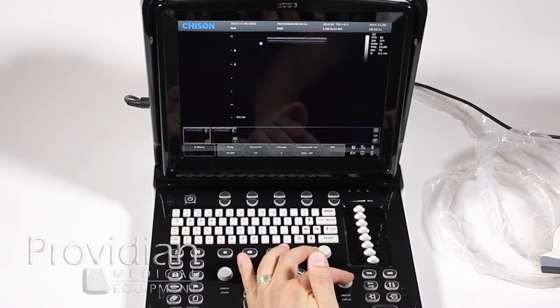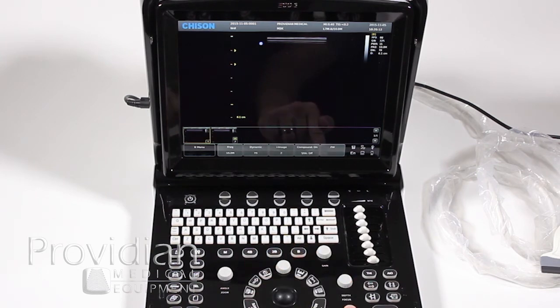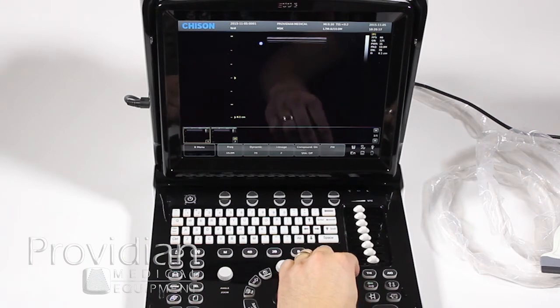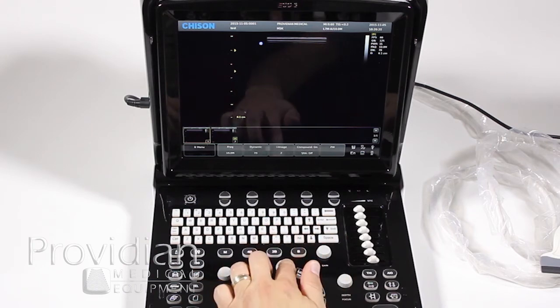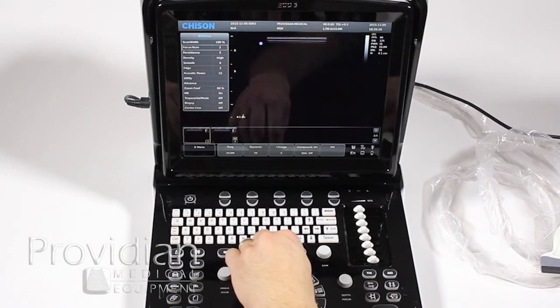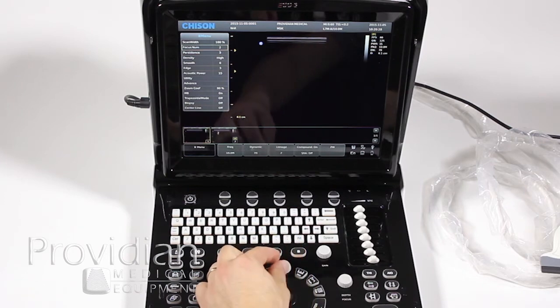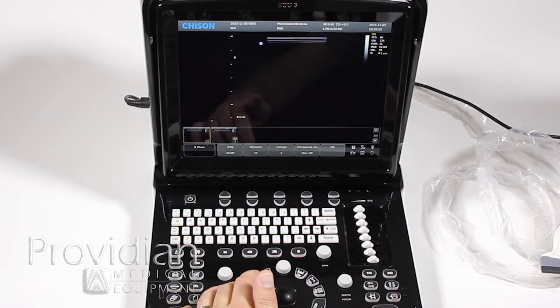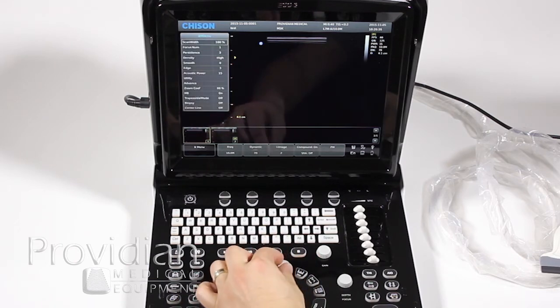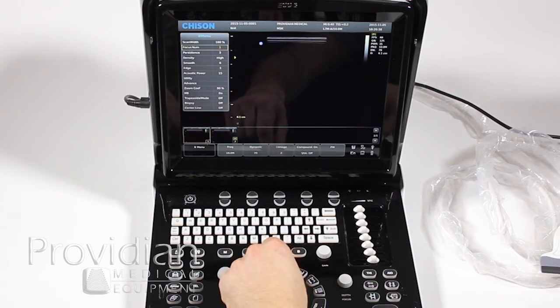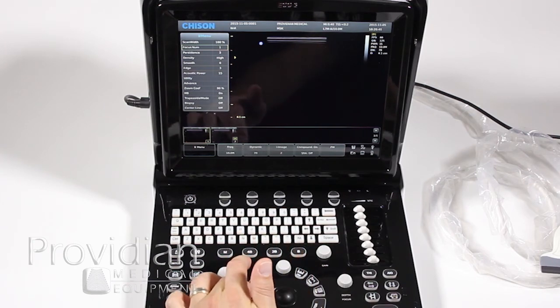If you want to change your focal position, click down and focus will be highlighted. You can then look at your focal zones and adjust your focal positions. When you want to change the focal number, go into that menu, push down, adjust the parameter, and then click exit. So the process is: press down, scroll, push down again to select, adjust the parameter, then hit exit.